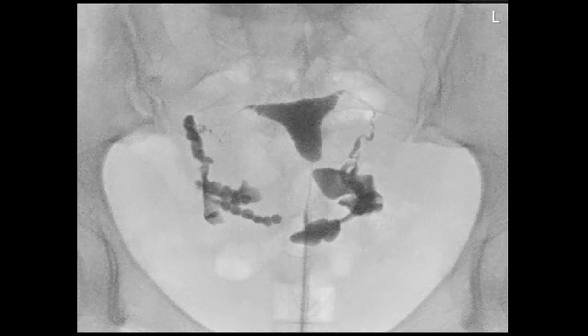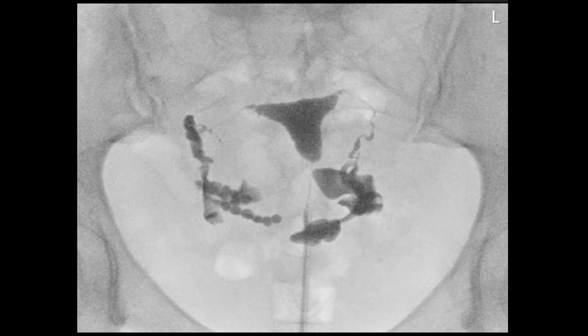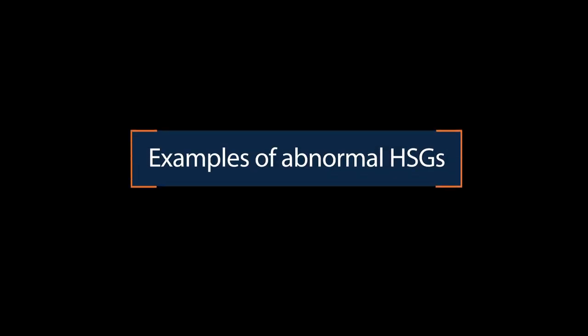Over here it is a short film. You can see the typical oil drops coming into the abdominal cavity from the right tube. And also from the left tube you can see streaming of the oil contrast into the abdominal cavity. So that means that both fallopian tubes are patent. This is an example of a normal HSG. Now we will show you a couple of HSG pictures with abnormality findings.